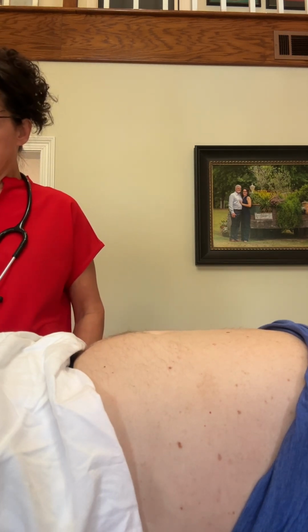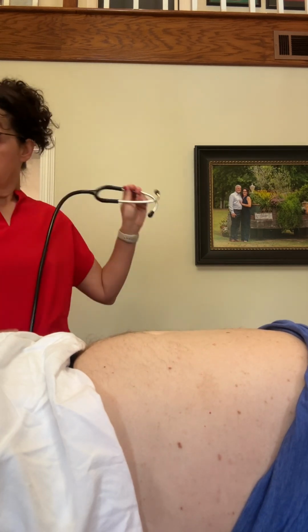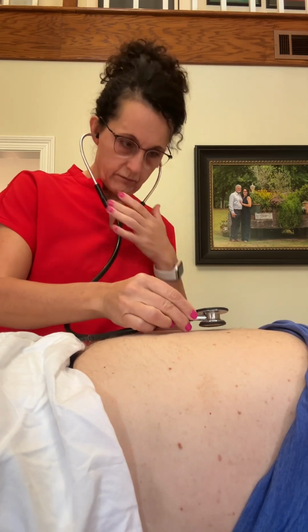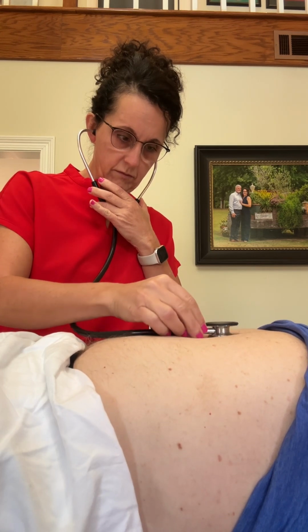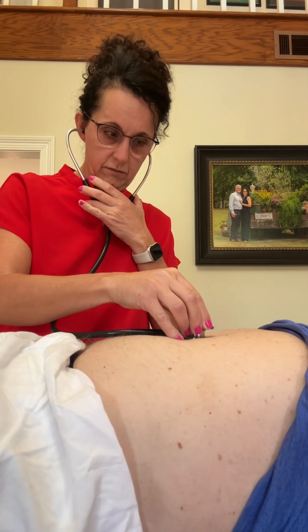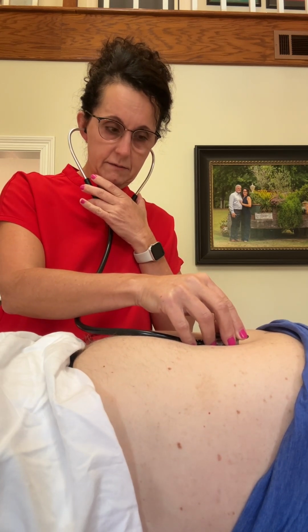Now we will auscultate vascular sounds and friction rubs. We'll auscultate the abdominal aorta. And this is with the bell of the stethoscope. This is slightly to the left of the midline.